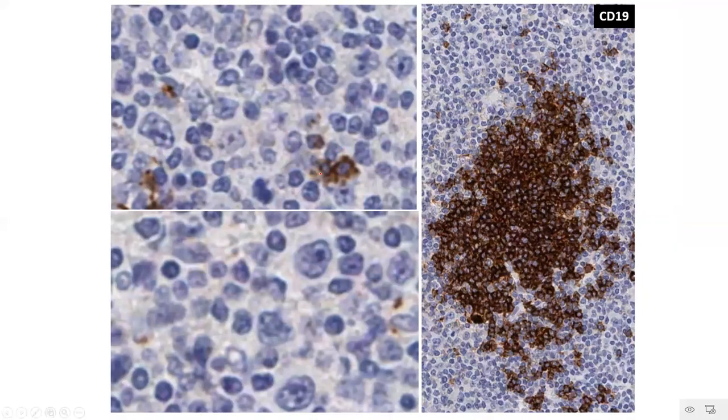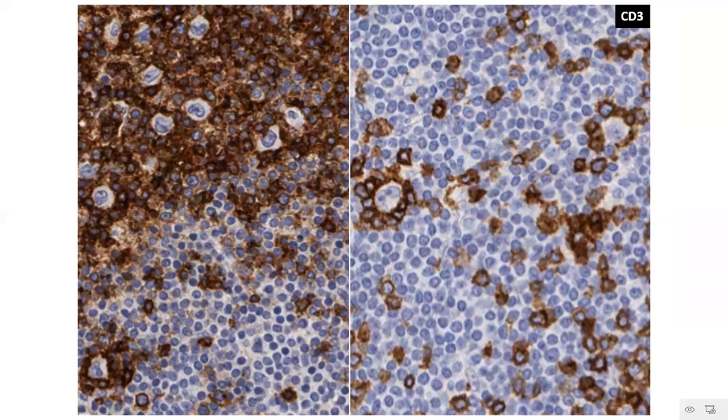CD19, also being a B cell marker, will show you the same kind of expression. There is a loss of expression of CD19 in these atypical large cells, and the T cell rosettes which are present as collars around these Hodgkin-Reed-Sternberg cells are also negative for it. CD3 has highlighted the exact same issue that I was telling you about. That is, you get these collarettes of T follicular helper cells which form a rim around the atypical Hodgkin-Reed-Sternberg cells, right?